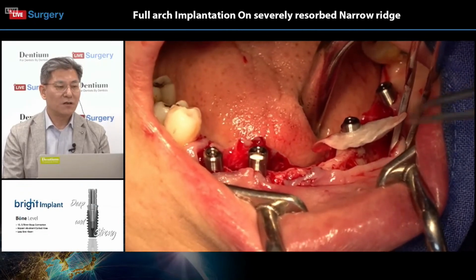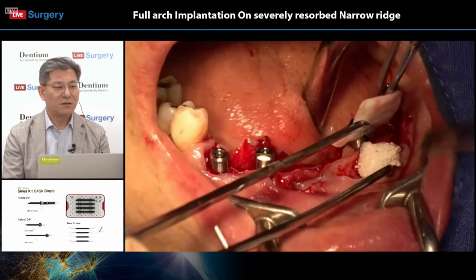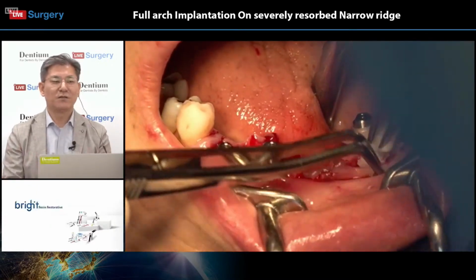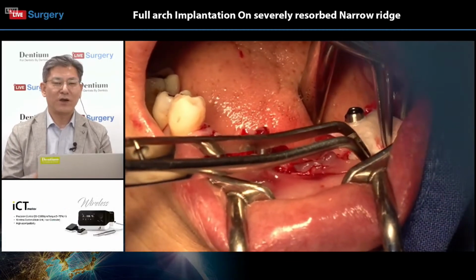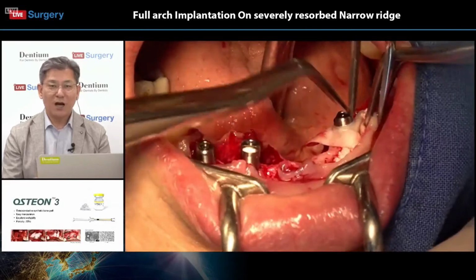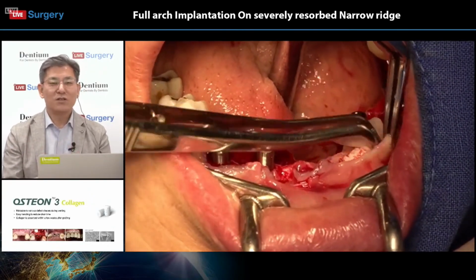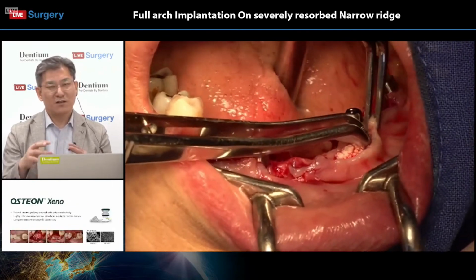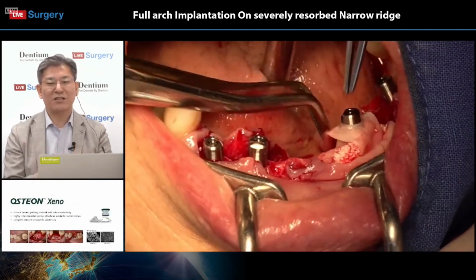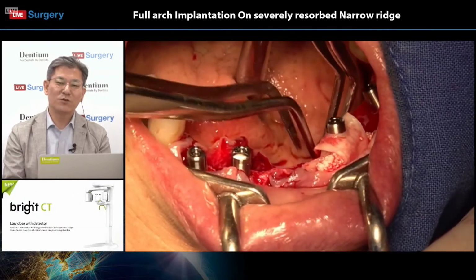So yeah. Now we can get a wider choice of barrier membrane. If you want a stiff type, yeah, you can go straight to version 1. But if you want the soft and resilient style, you can turn to version 2, right?